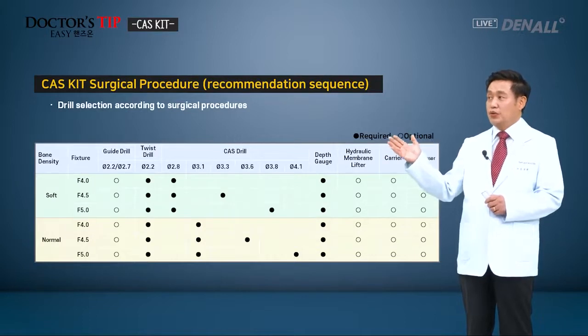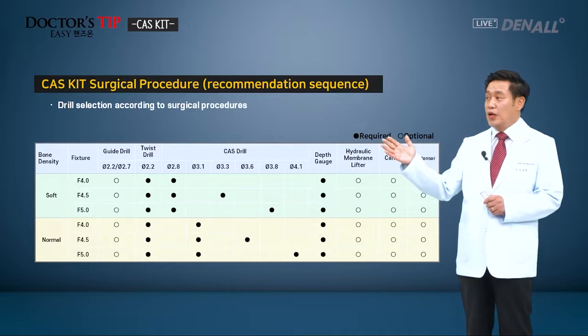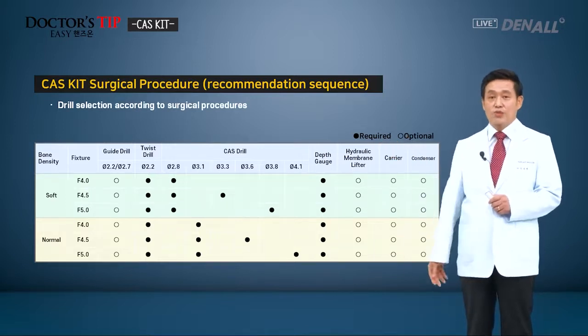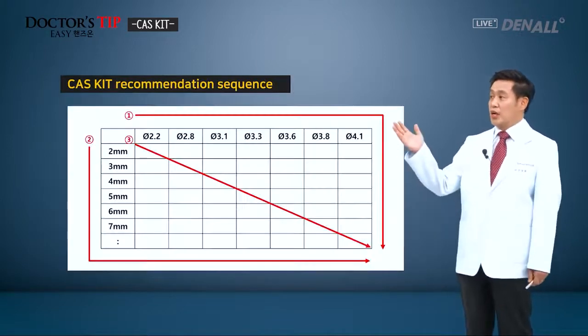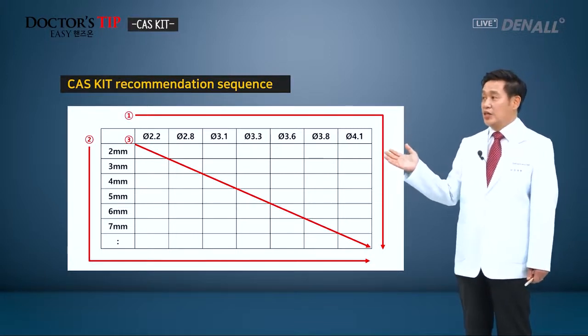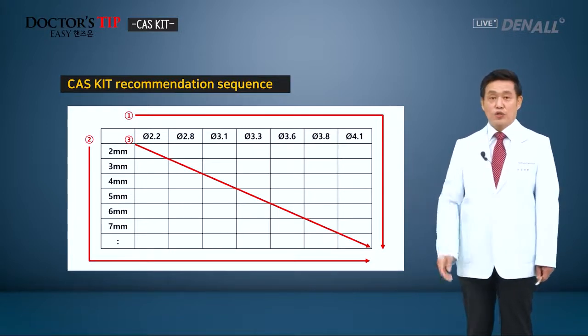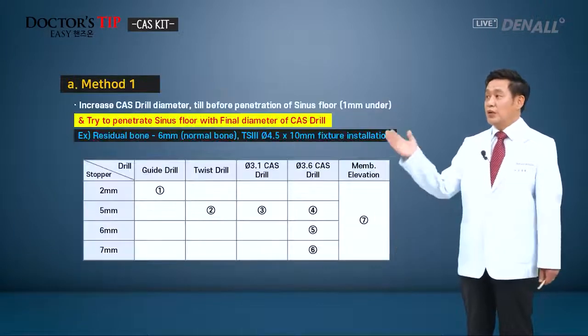There's a recommended sequence for the CAS KIT surgical procedure. I will try to explain it in an easy way so that you can understand better. There are basically 3 sequences of drilling in our recommendation, and I will use some diagrams to explain it.